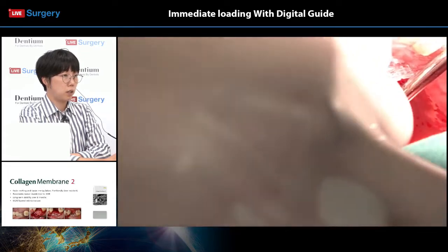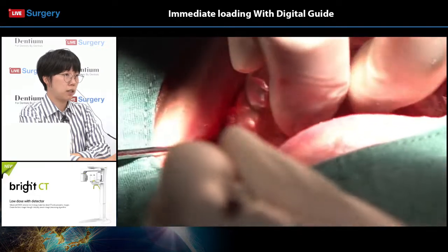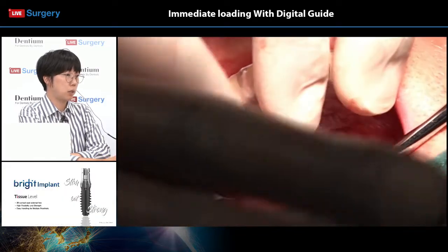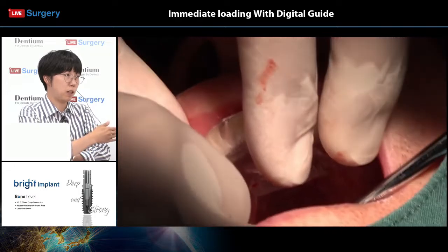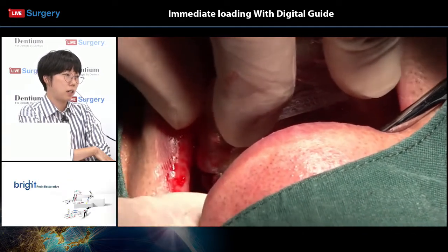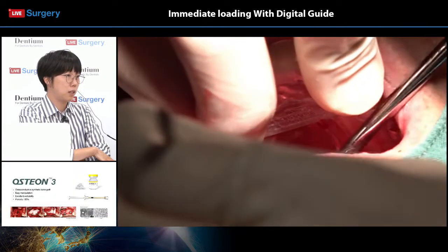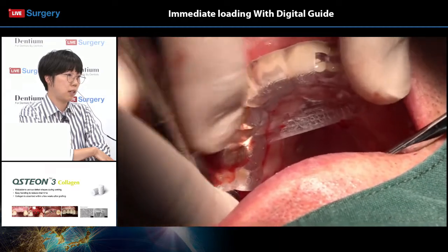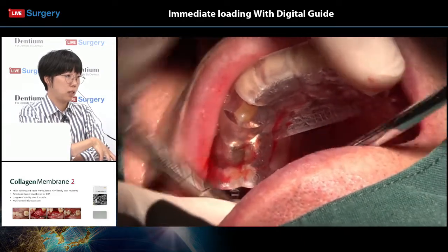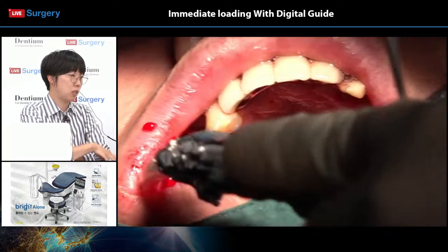Okay, so after flap reflection, the good thing is that even if you've placed your implants beforehand using a digital guide, you can always confirm the actual position after reflecting the flap. And it's sometimes a thing that is recommended, or a thing a surgeon should do once in a while, I think, or once in a lifetime, because it's actually very important to confirm that the implant position according to the digital guide actually goes into the ideal bony housing that we actually want it to be positioned in.